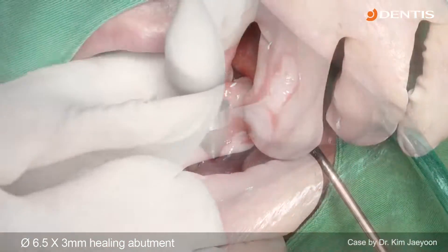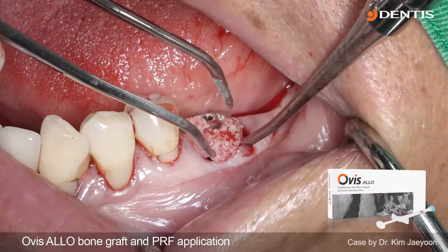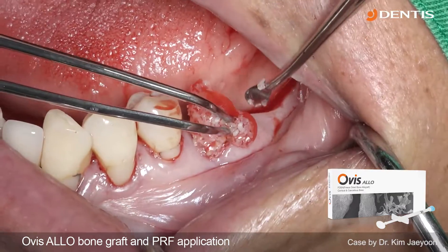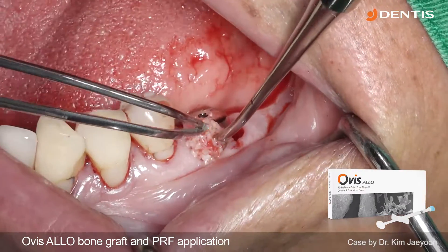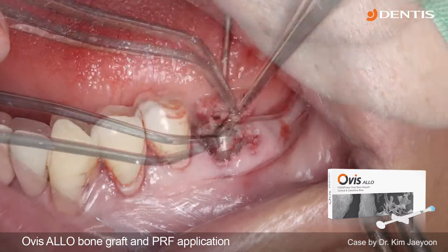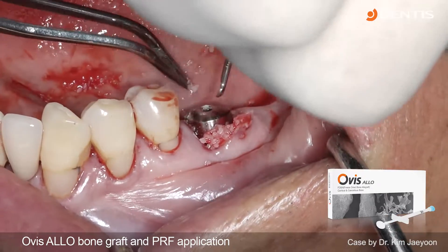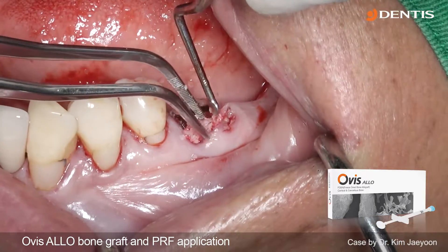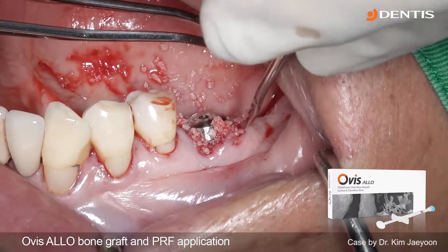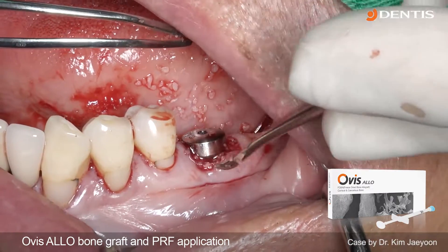Then I connect the healing abutment. I use allograft bone graft material for the bone grafting because there is a large-size defect on the mesial side, and there is also a defect on the distal side of the extraction socket. So I gently insert the bone graft material into the socket and defect site.